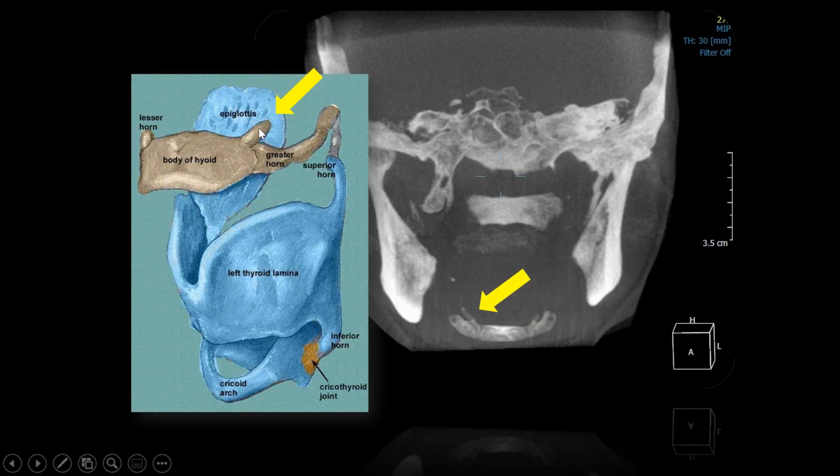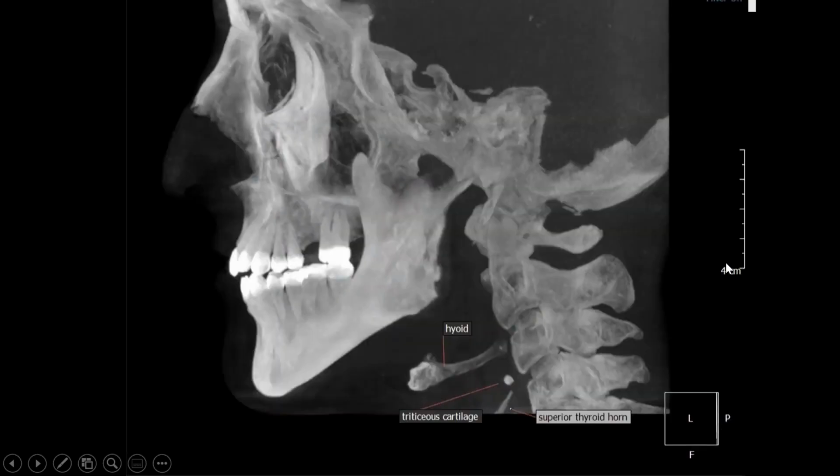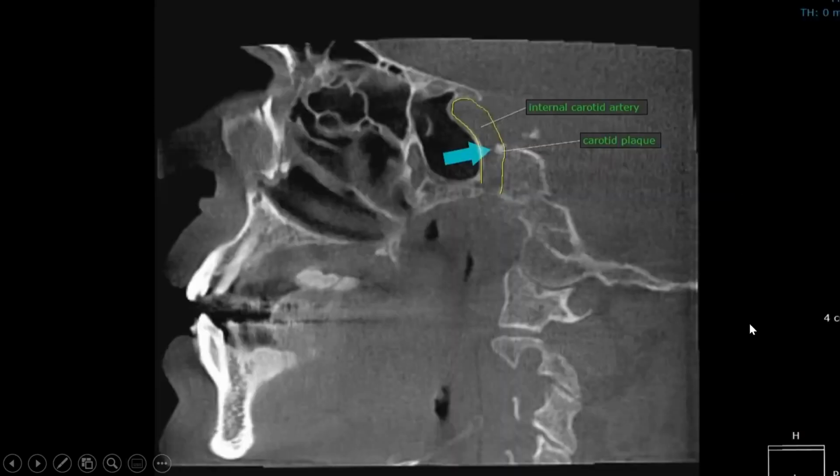But in sagittal, you'll recognize a part of the hyoid. Here we're looking at the lesser cornu, the yellow arrow here and here, and then the superior thyroid horn. So sagittally, when we did a MIP image here, you can see the hyoid bone, you can see the superior horn of the thyroid cartilage, and on many scans, you'll see a rounded radiopacity. It's not a carotid plaque. It's a normal structure we visited last week called the triticeous cartilage. I've never seen any pathology with it, but it kind of looks like an opacity. You can imagine what it looks like on thin section. You kind of get confused. So now that you know what it is, you shouldn't get confused.